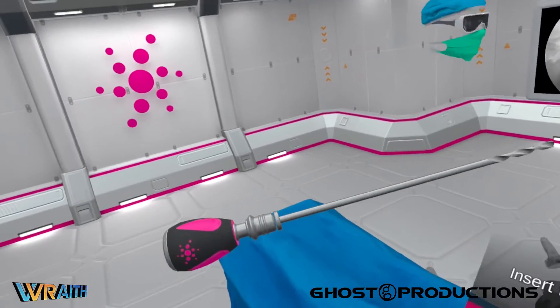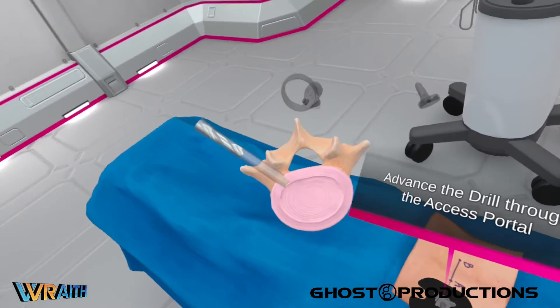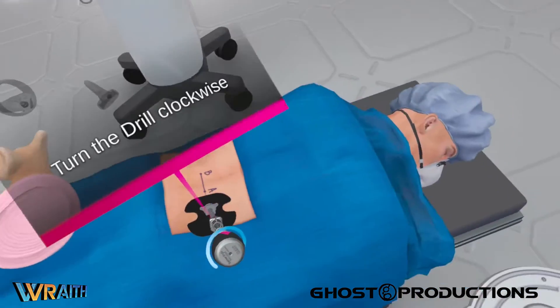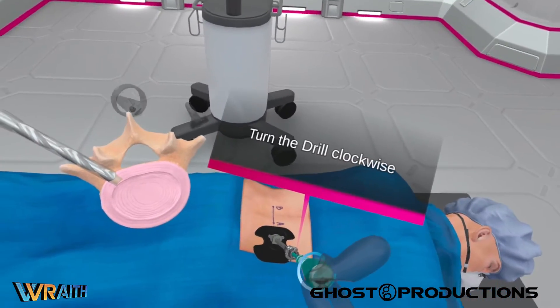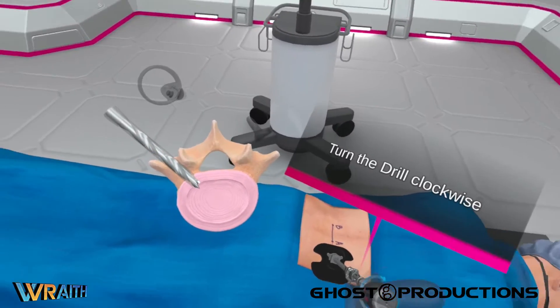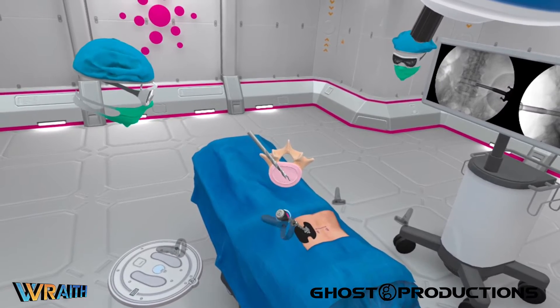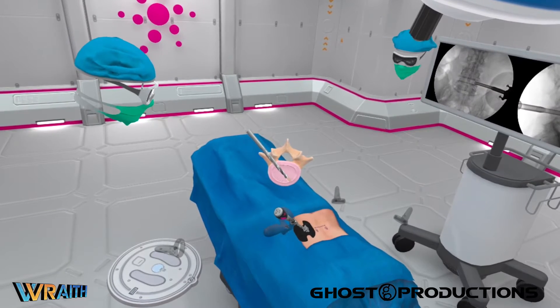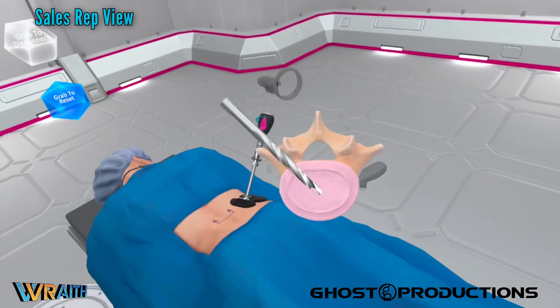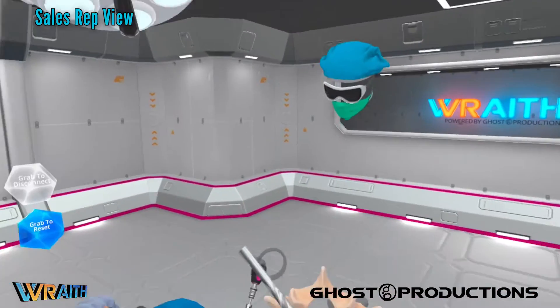So we'll start with the drill to make an initial channel. We have this visual aid here to show what's happening on the inside of the body. This is the distal tip of the drill — you can see it's a little bit transparent — that's the end of the access portal. You get a good view of what's engaging with the end plates. So you guys are going to make this appear for me in the OR? That would definitely be a great goal to have — we should probably try to shoot for that.